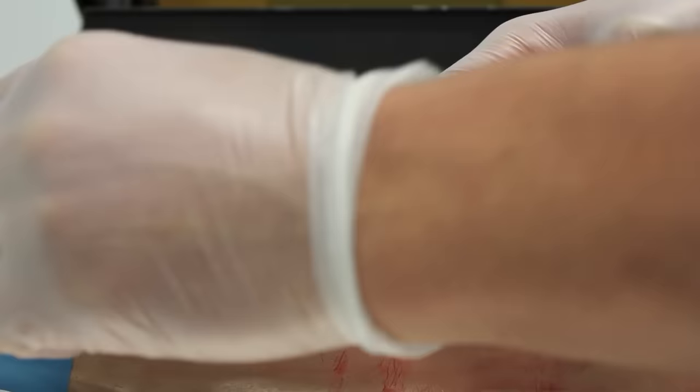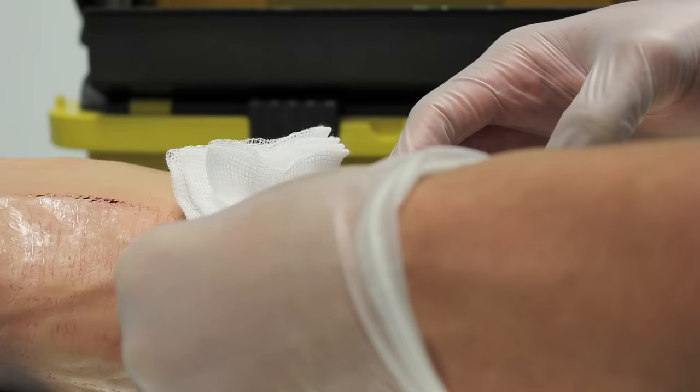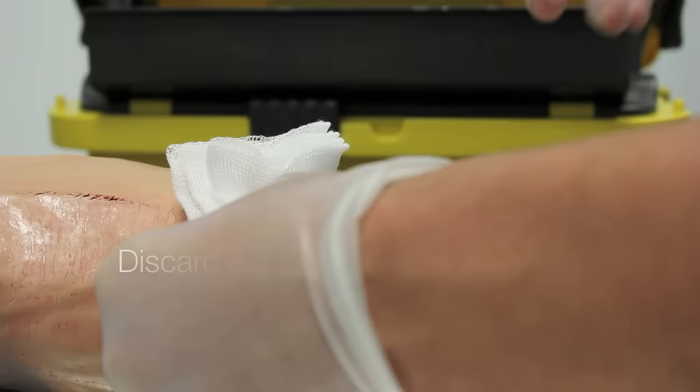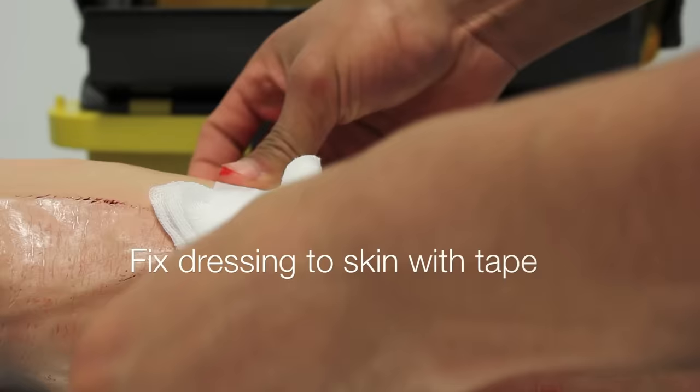Before you take the needle out, remove the tourniquet. Get some cotton wool and cover the site of the needle injection, then remove the needle — only putting pressure on once the needle is out. Then get the patient to hold the cotton wool or gauze in place for a minute after you've taken the needle out, to catch any bleeding.